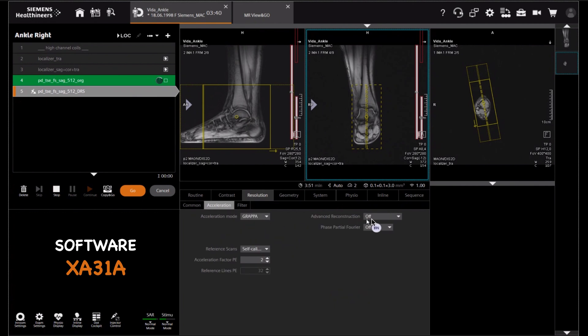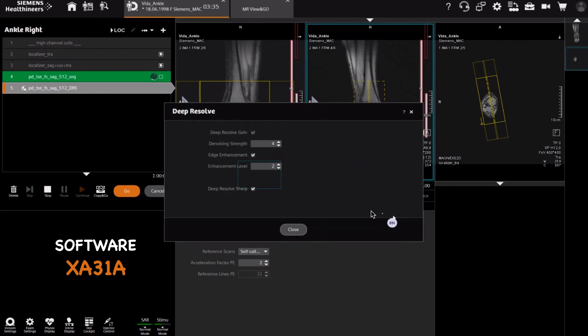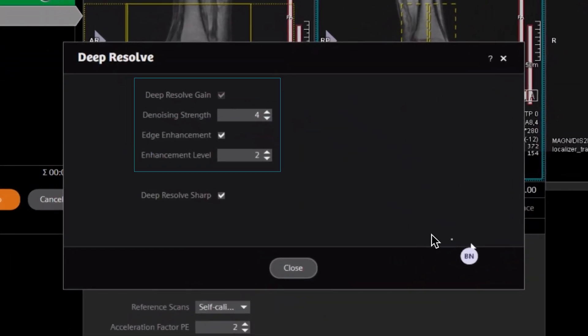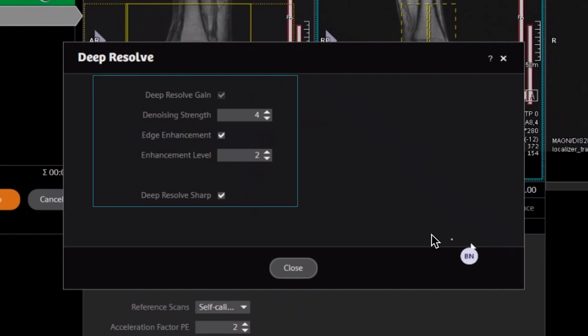Before we continue, I just want to mention that with DeepResult you can use it in three ways: one is that you can gain SNR, or you can use it to get sharper images, or you can get a combination of both of them. So enough talking — let's go and I'll show you some results.